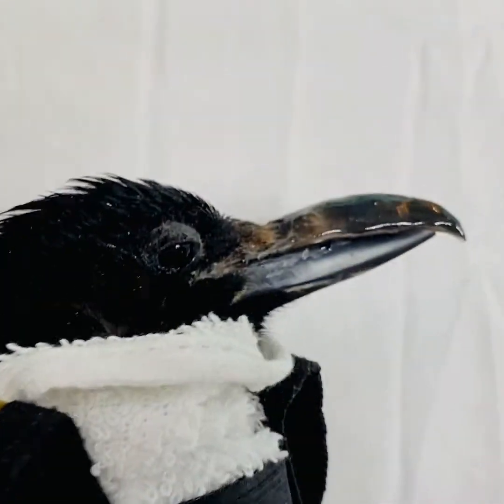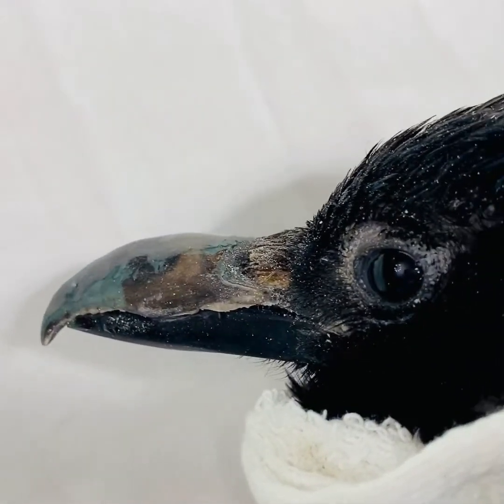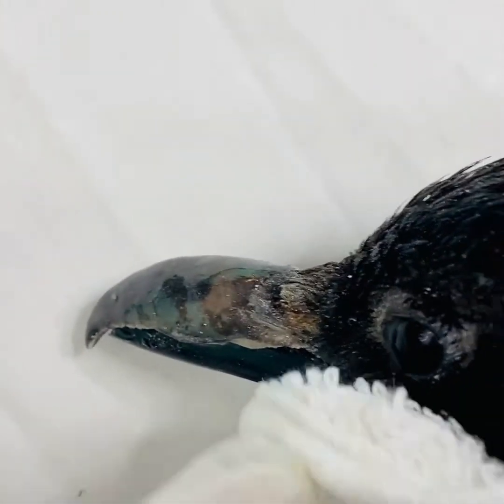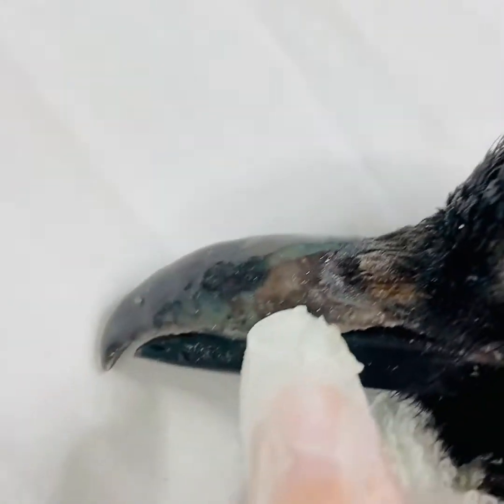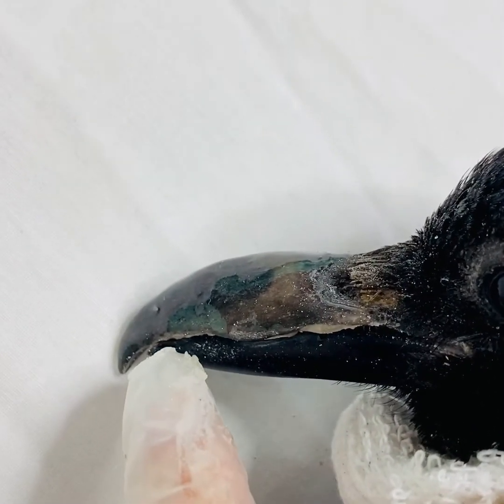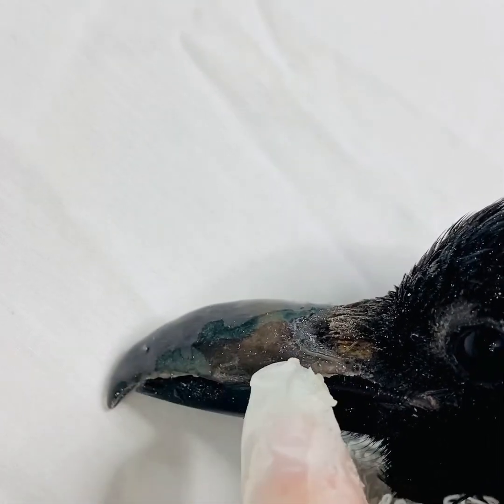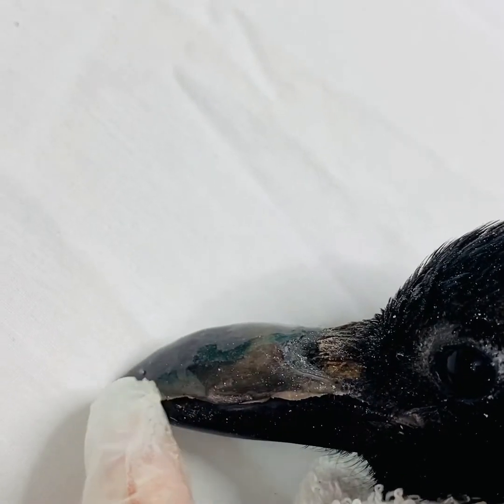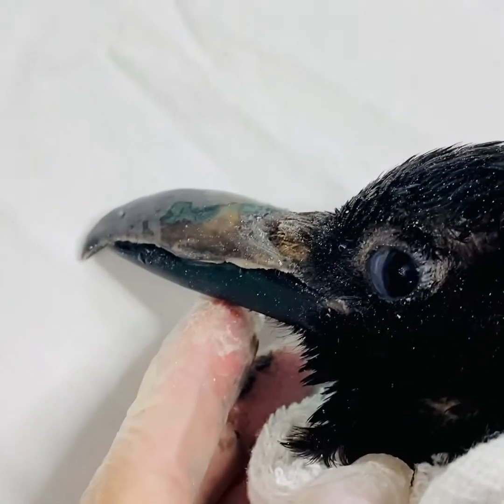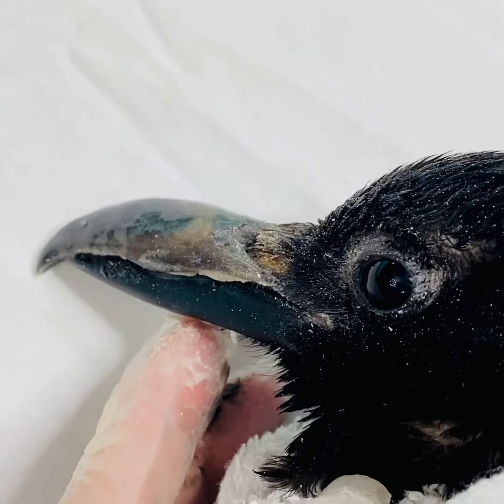And that, my friends, is how you successfully restore a beak. This is a successful beak reconstruction. Now as the beak grows out, the part that's naturally there will grow out and this shape will maintain, so it will have to be refiled and shaped and slightly trimmed as it grows out until it's entirely his own natural beak. Other than maintenance, it's fully functional even now — he can pick up things and he's already bitten me, which is about the best endorsement I could get.